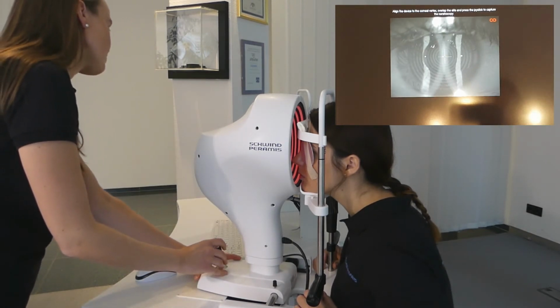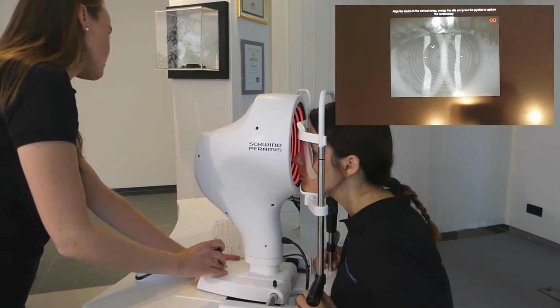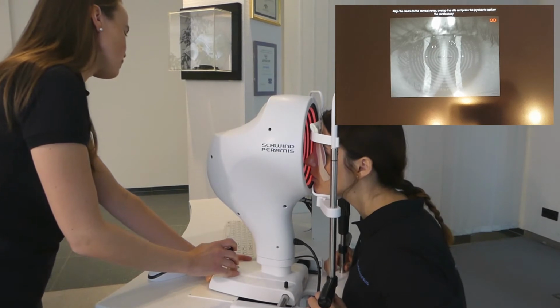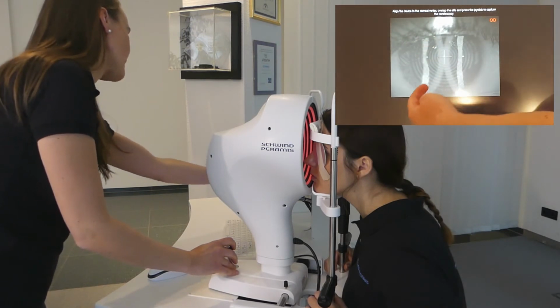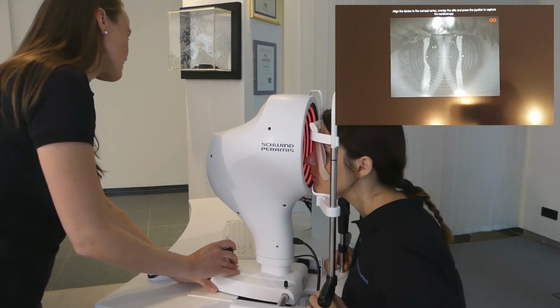My patient is still fixating the red spot in the device. Additionally, next to the centration, I have to bring the device into a perfect focus, and therefore you see I have two curved lines, one here and one there, and I have to overlap these two curved lines in the center.